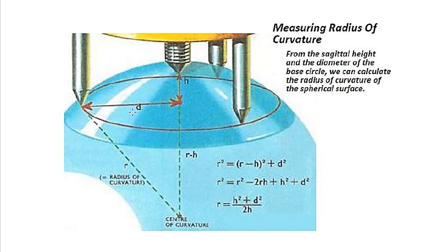So this is actually a radius. There's the center, and then the end of this base circle. The diameter is from here all the way to the other end, crossing the center. Don't get confused just because this picture is using d as your diameter. D here actually refers to the radius. The diameter is going to be from here all the way to the end, crossing the center.